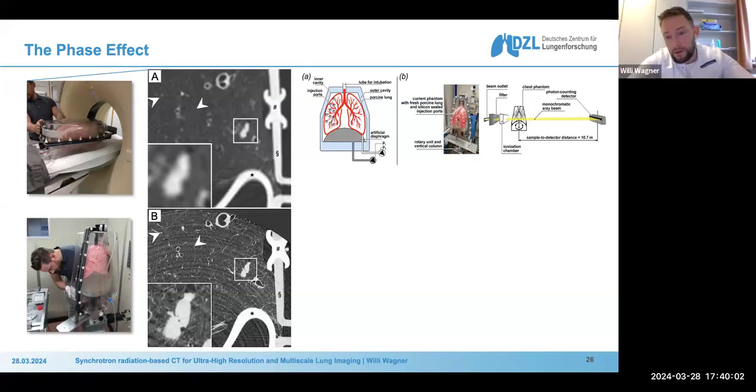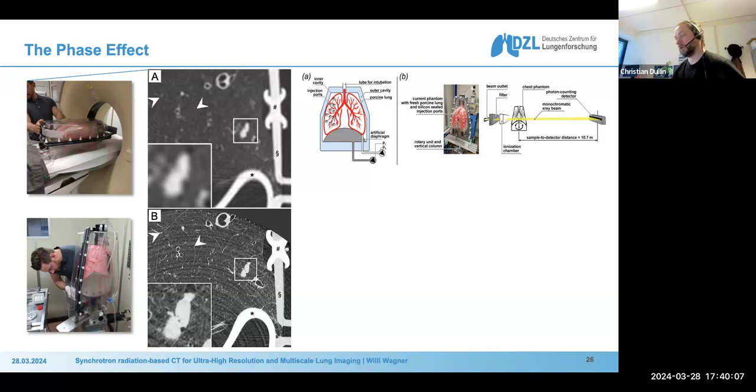But yeah, Christian, maybe a tiny bit higher. That is true. So Christian, we use the exact same setup in the clinical CT. Yeah, no, it's a question about the tissue around, not so much about the setup. So there will be more tissue around in the patient, of course, and there will be a little bit of scattering and something else that will increase the dose.